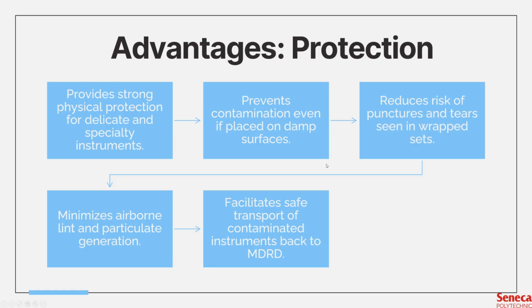They also protect the sterile contents from moisture, dust, and handling damage. When properly sealed and stored, they maintain a longer shelf life without compromising sterility. So this level of protection is one of the main reasons why many facilities have transitioned from wrapped sets to containerized systems.